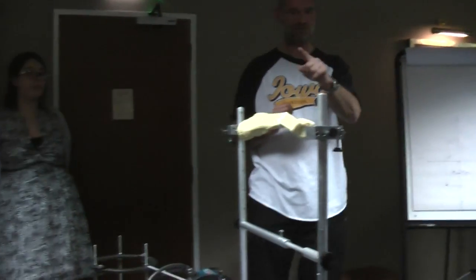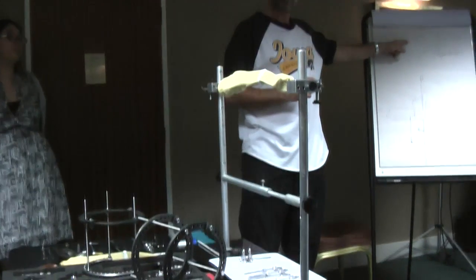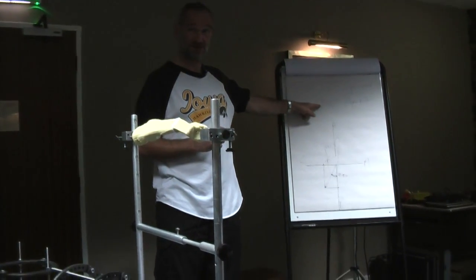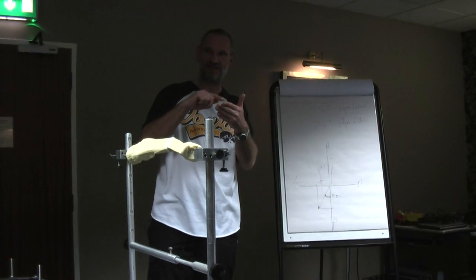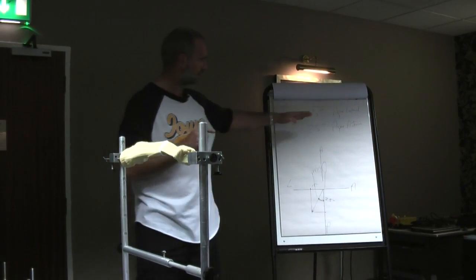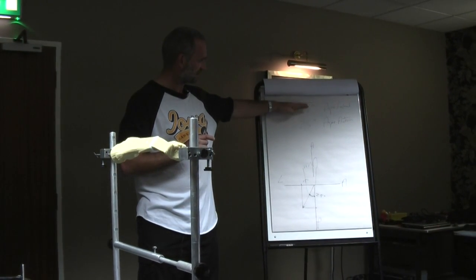All right? When you measure your bone, you will find 15 degrees of apex lateral deformity. You will find 25 degrees of apex anterior deformity. I've even drawn you a foot because it's a left foot. All right, so those of you that were drawing the right foot from yesterday afternoon's lecture will have to turn your paper over. Okay? 25 degrees apex anterior, 15 degrees apex lateral.